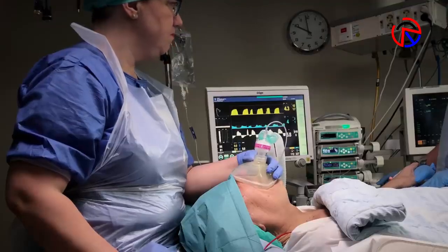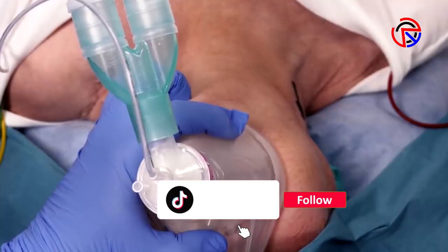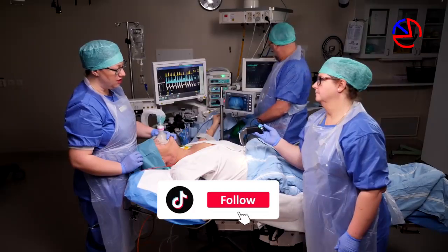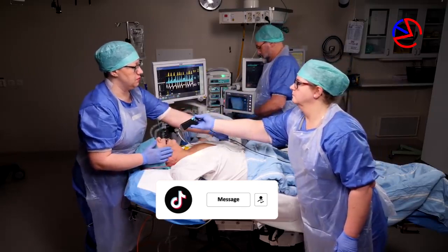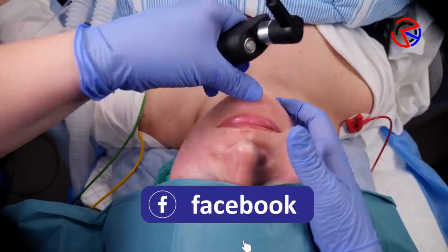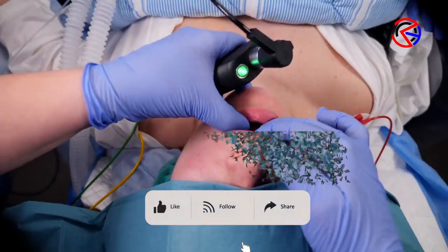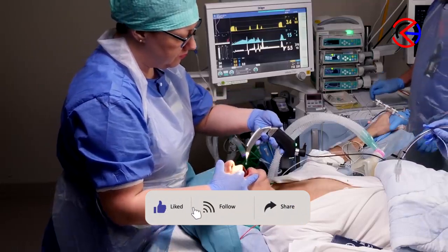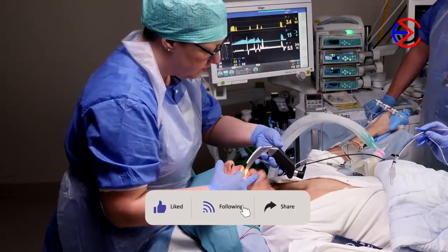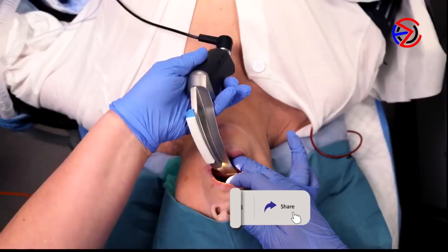Open the patient's mouth with your right hand and hold the laryngoscope in your left, not too tight, with 3 or 4 fingers as close to the blade as possible for precision and control. Insert the blade in the right side of the mouth, carefully pushing the tongue aside. The aim is to create an unobstructed line of sight to the larynx by pushing the tongue to the left and lifting the epiglottis, exposing the vocal cords. This requires precision, not brute force.